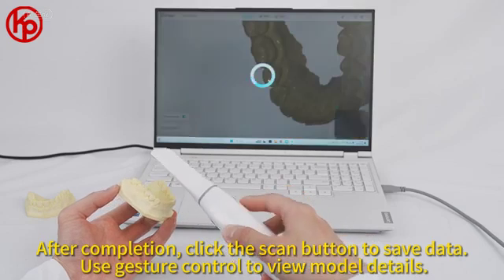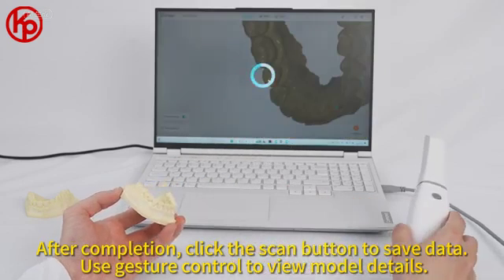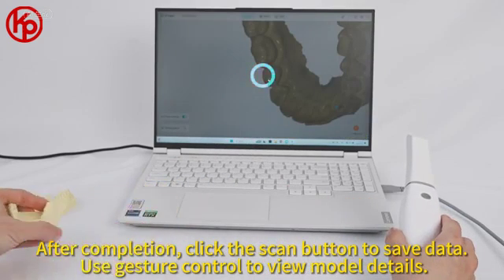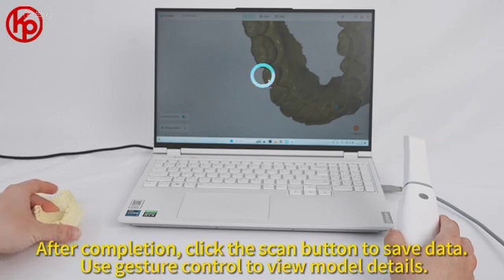After completion, click the scan button to save data. Use gesture control to view model details.